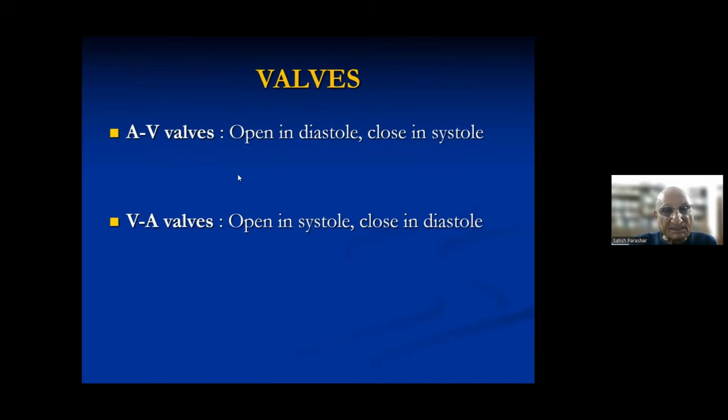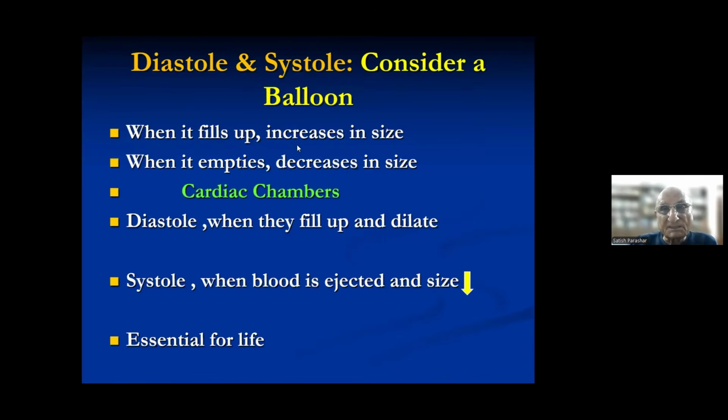Secondly, I put a stress on diastole and systole because I find that till the last day of the hands-on, persons are not very clear about this thing. And I gave you the example of a balloon. When you fill up a balloon with water or air, it increases in size, and when you empty it, it decreases in size. Same thing. This is diastole, this is systole. Same thing in cardiac chambers. When they fill up, they dilate like this. And in systole, when blood is ejected, they become smaller.